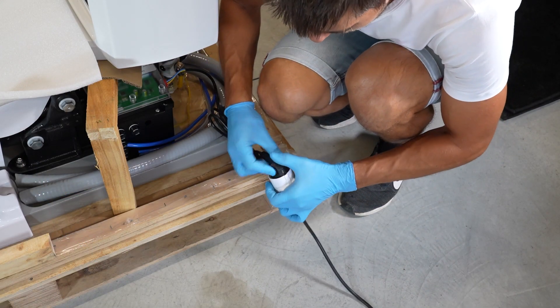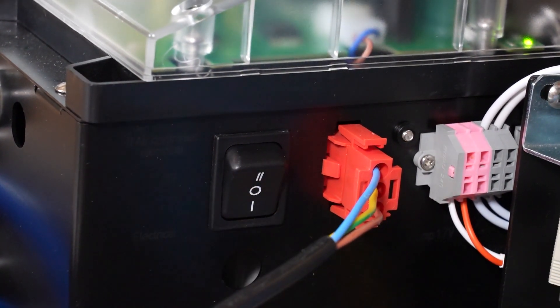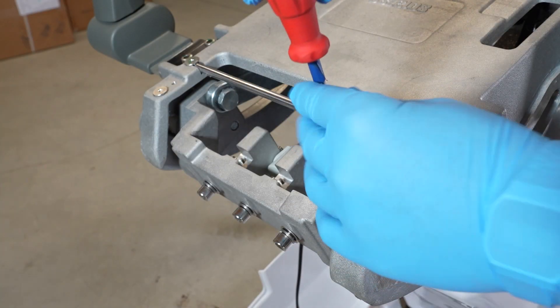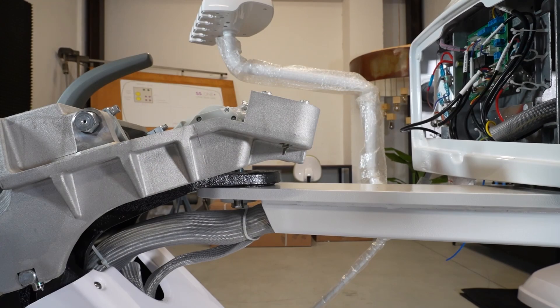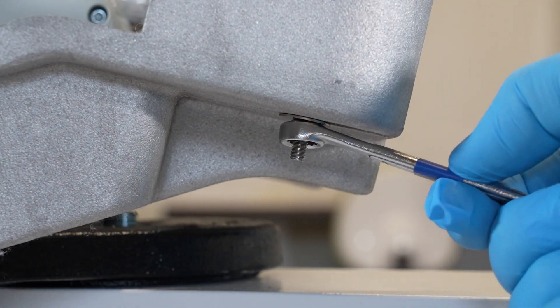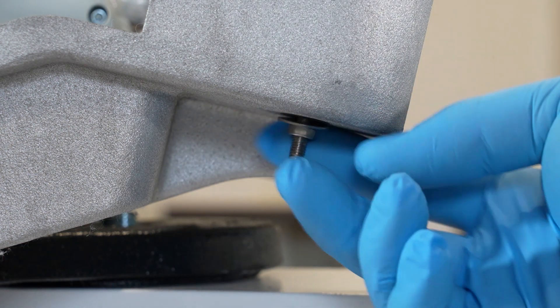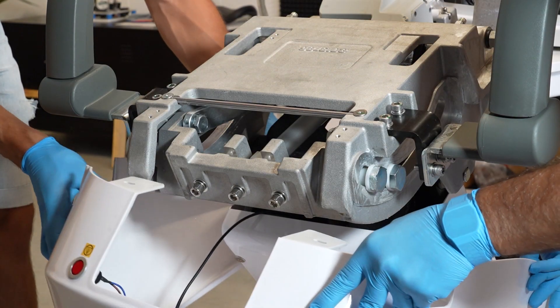Turn on the unit and raise the seat. Remove the four screws on the seat frame. Place and fix the cover.